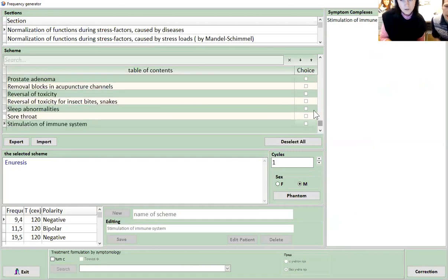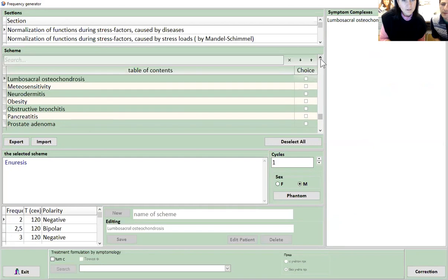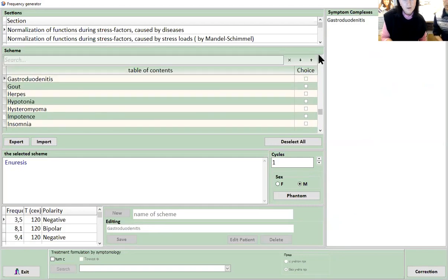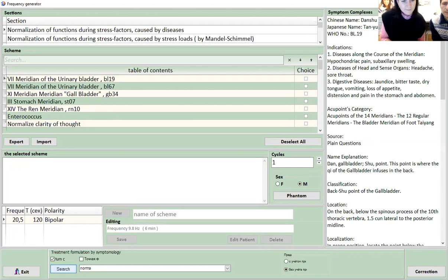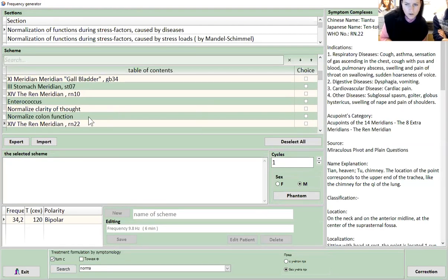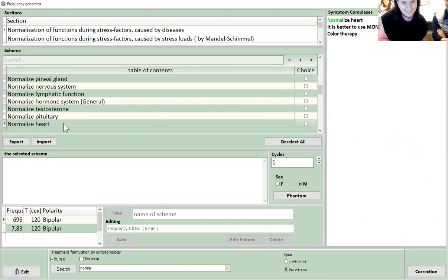Interesting. It's a little bit different from the Swedish version. Can you find the heart? No, but actually it should be in these frequencies. Normalize. Here it is. Normalize, and we're looking for normalize of the heart, and here we found it. It's better to use Monicor on points and color therapy. Okay, but anyway, we choose this one.